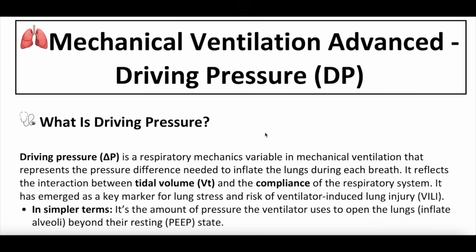Today's topic is one that a lot of people have kind of requested or brought up questions on. And it's a Mechanical Ventilation Advanced series, specifically talking about driving pressure.